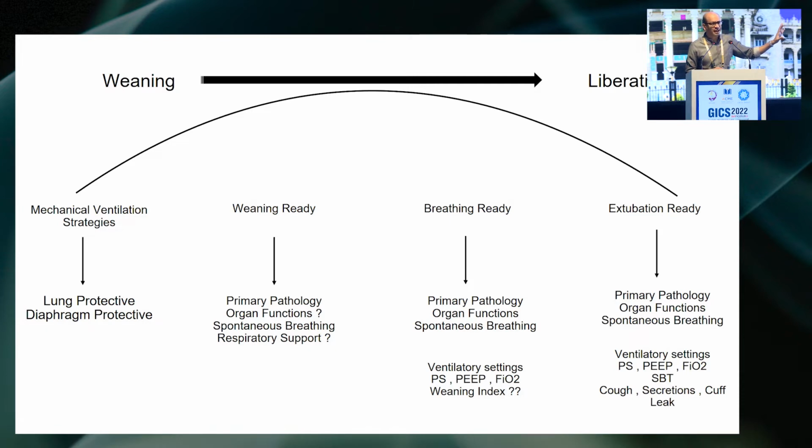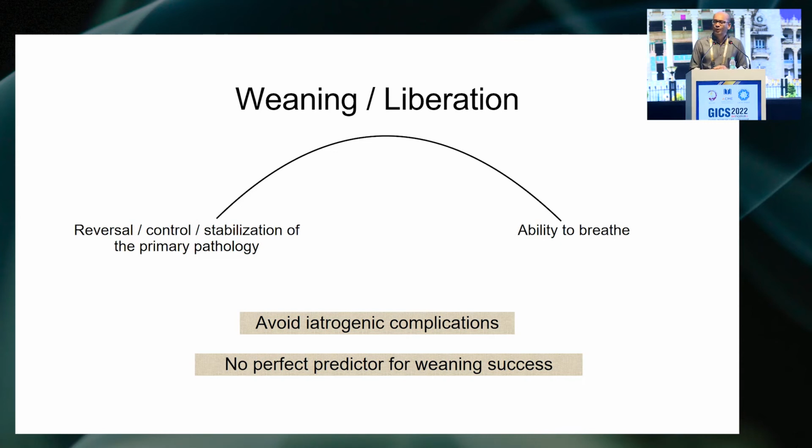And that is something that we see day in, day out, isn't it? Close to 75% of your patients can be extubated after the first spontaneous breathing trial, and they need not go through this entire process. So if I look at weaning or liberation, the only two things that matter to me are, one, what is happening to my primary pathology. The reason why I have intubated the patient, is that primary disease under reasonable control, recovery or reversal. And the second thing that matters to me is, is the patient able to breathe? Probably the only two things which we all should look at are these two.